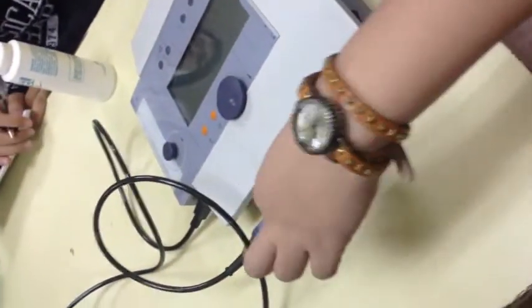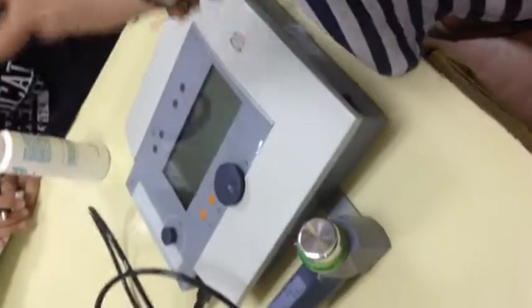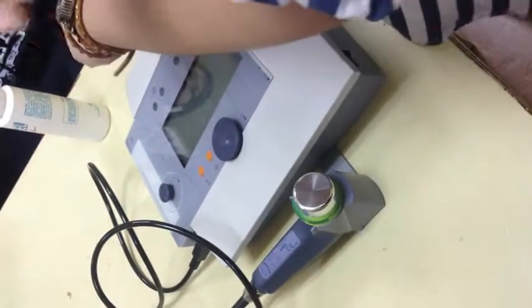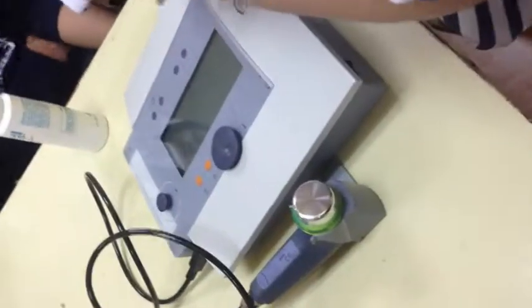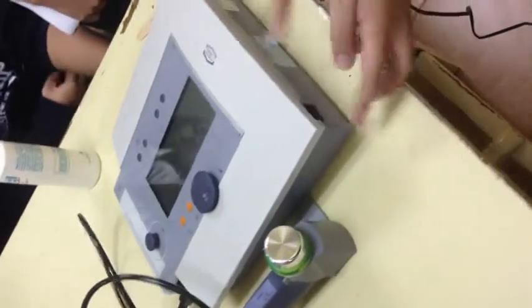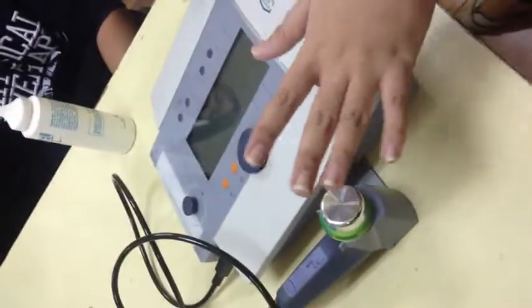So makikita natin yon pag nakailaw yung green ring dun sa head. Pag nakailaw siya, ibig sabihin, hindi siya nag-i-emit ng sound. Okay? Mapapansin nyo, pag nilagay nyo siya in contact dun sa skin, mamawala yung ilaw, meaning nagsastart na siya mag-emit ng sound. Okay? So, yung on and off switch niya, nandito sa likod. So, yun lang naman yung switch sa likod, so hindi naman kayo mga confused. Okay? So, nakita nyo nakailaw, so that means walang sound energy na ini-emit.